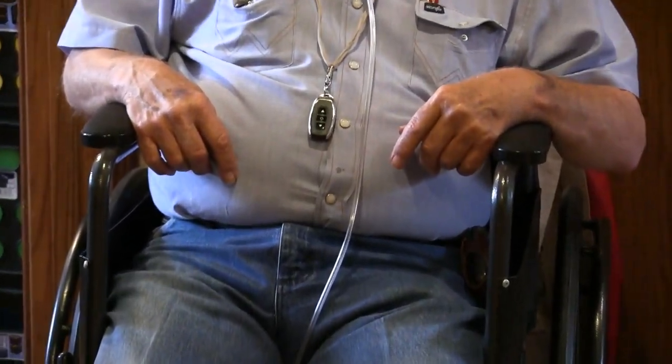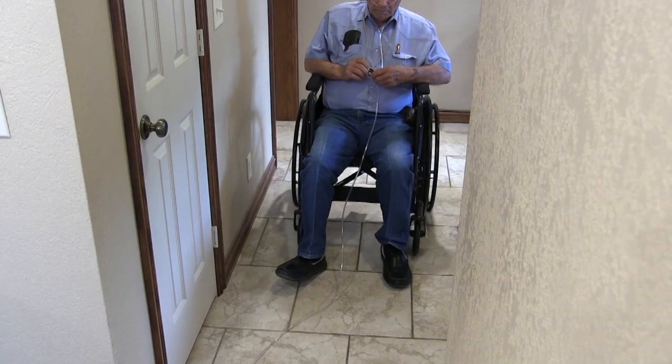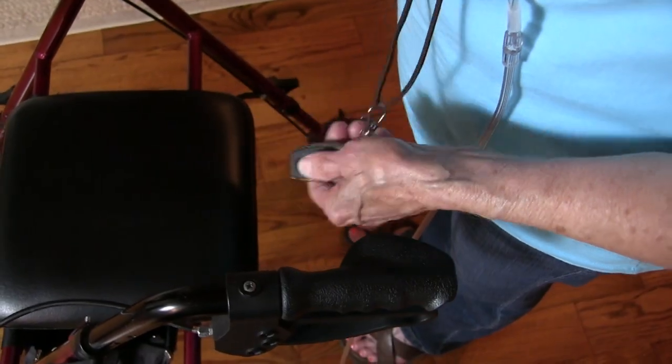The Oxytube Control Remote is perfect if you're in a wheelchair. If you use a walker, the OTCR is perfect.